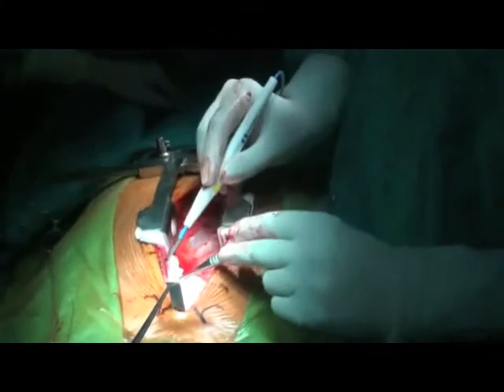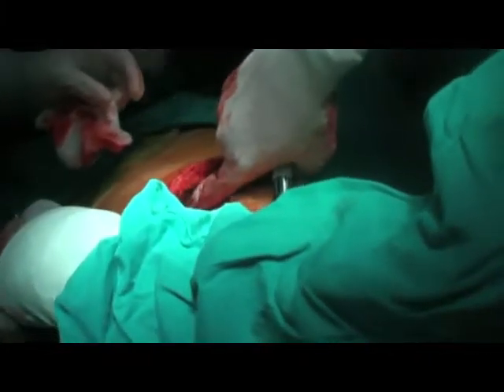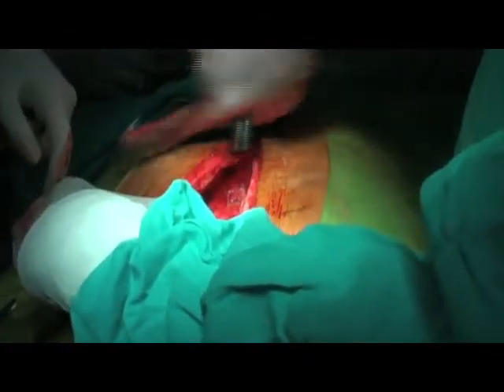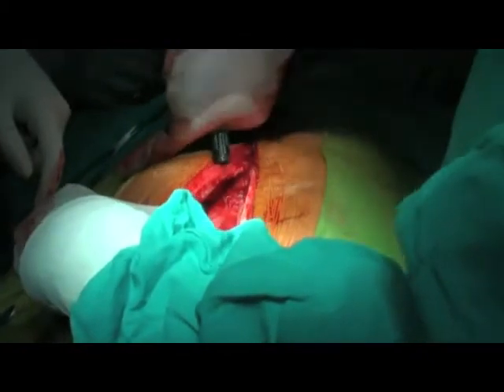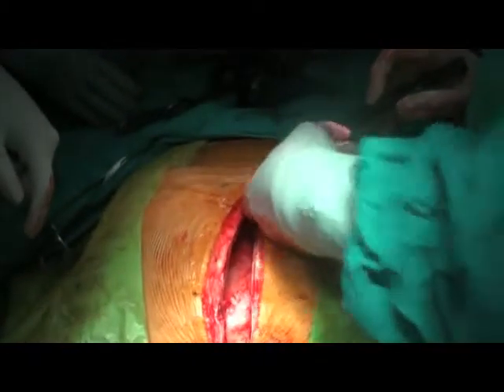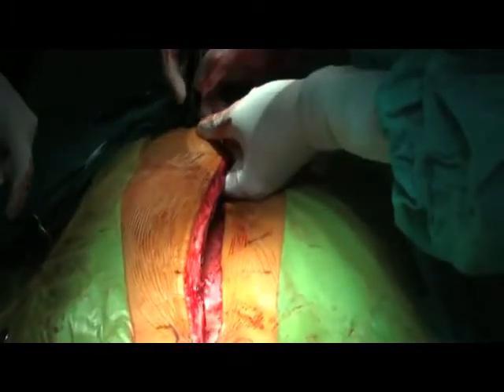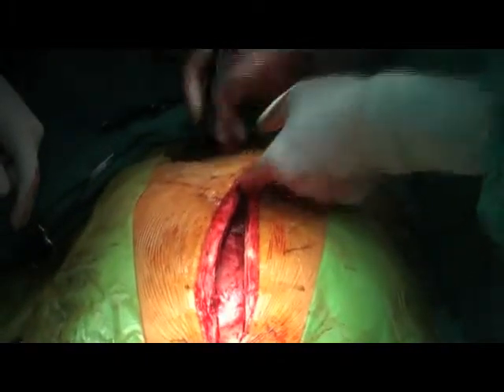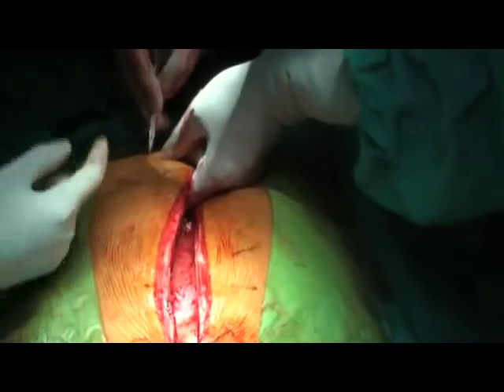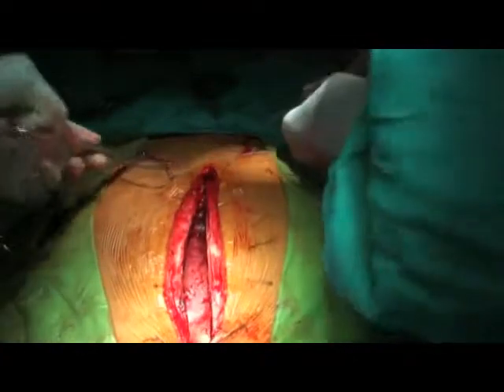Now the sternal closure begins. In this operation the pleura on the right and left side are both open. When you put the pleural drain, the direction of the drain should be such that it goes over the diaphragm — the bottom part below the lung — so that whatever collection takes place comes out through the drains. If you put the drain straight, it may not drain properly. You make the cut on either side of the sternum, taking two stitches: one to fix the tube and another mattress suture to help close the wound when the drain comes out the next morning.